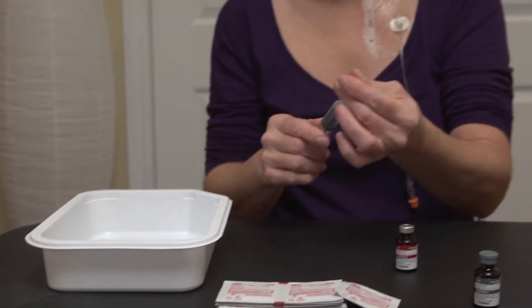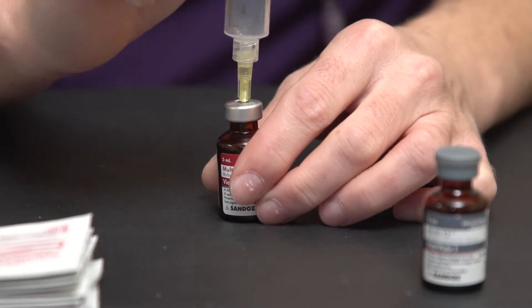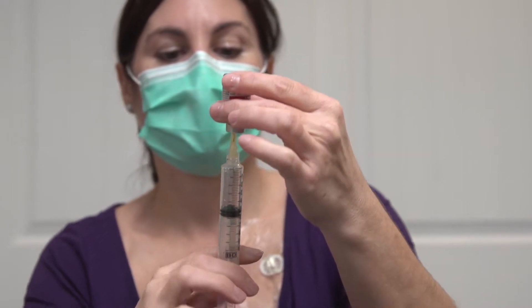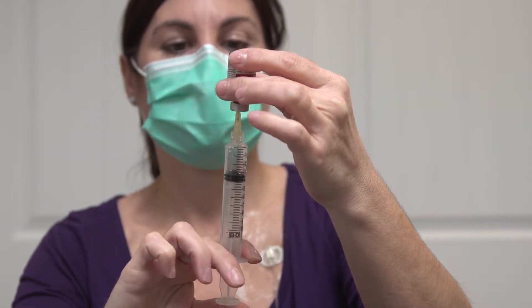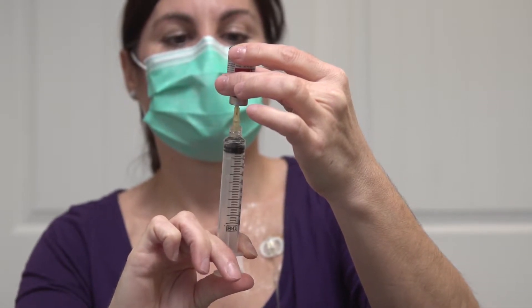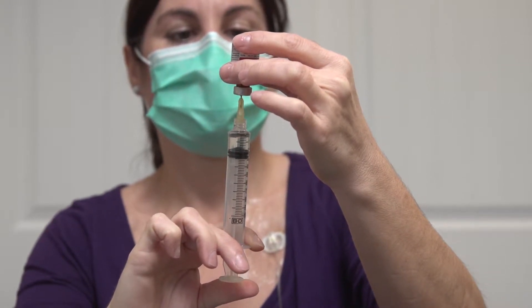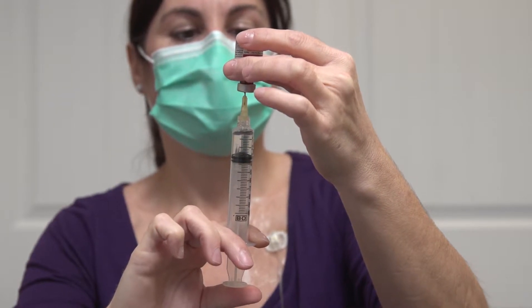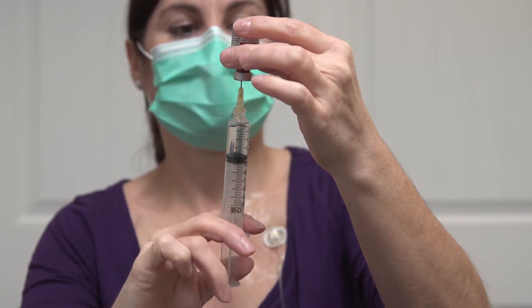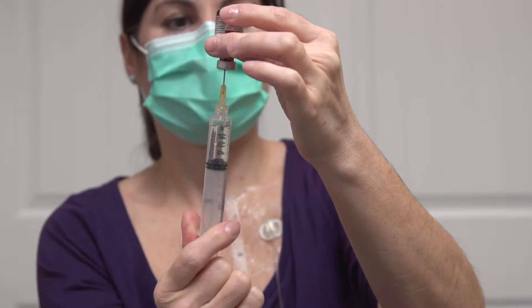Hold the syringe in one hand and pull the cap off with the other without touching the needle. Insert the needle into the center of the vial stopper. Hold the vial and syringe upside down and push the syringe plunger to inject air into the vial, and then draw the vial's contents. If necessary, pull the plunger back to fill the syringe completely.